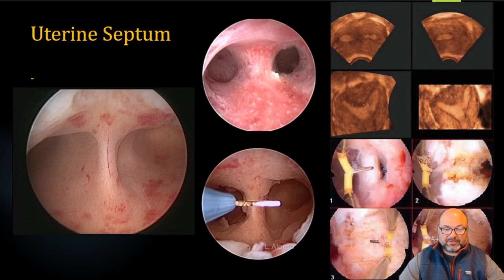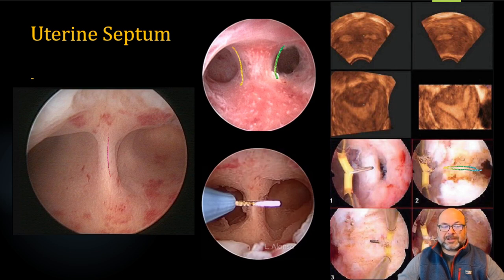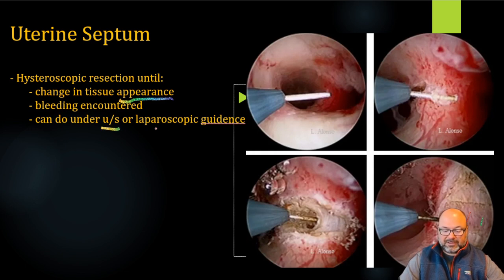Here we've got this nice relatively thin isolated septum in the midline, and here's one that's a bit more broad. Here's our little bar electrode being used to push up into that septum and resect it. This is kind of the different stages of resection — pushing in, you can see the division of tissue, getting to the point of communicating the left and right side. As far as how far do you take this — when do you stop that resection? You have a couple of indicators. One is that you get a bit of a change in the tissue appearance — you can see this area getting to be a little bit more pink with a bit more blood flow. When you get into active bleeding, you know that you're getting into more normal myometrium and that's a time to stop. You can also use ultrasound guidance for this, or look laparoscopically to see when you might be getting to the end of the septum and into the normal myometrium.